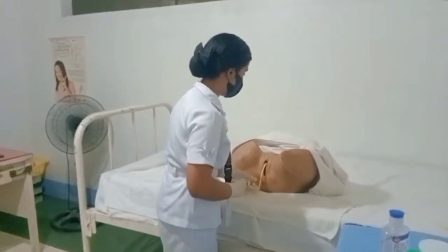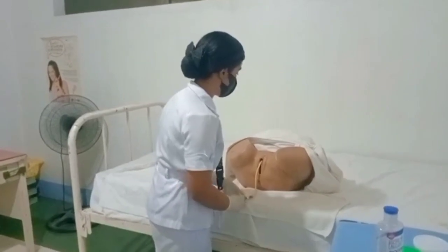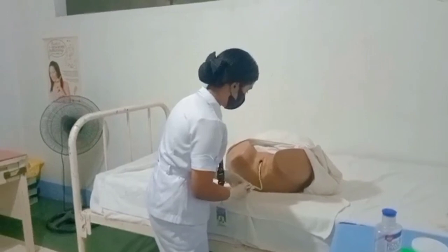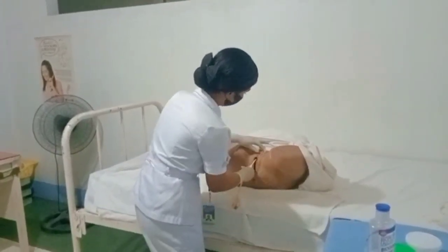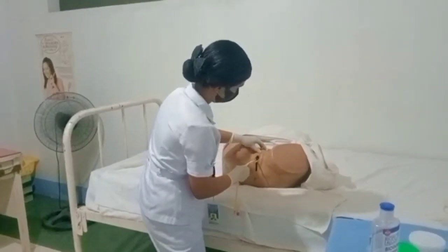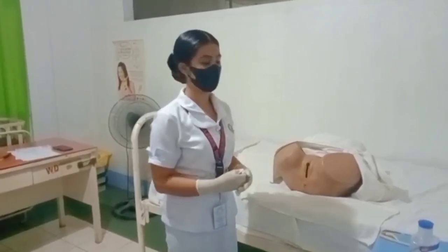And then I will gently pull out the catheter, and then I will ask the client to take a deep breath. Ma'am, can you take a deep breath as I pull the catheter out? And next, I will cleanse the perineal area of the client.